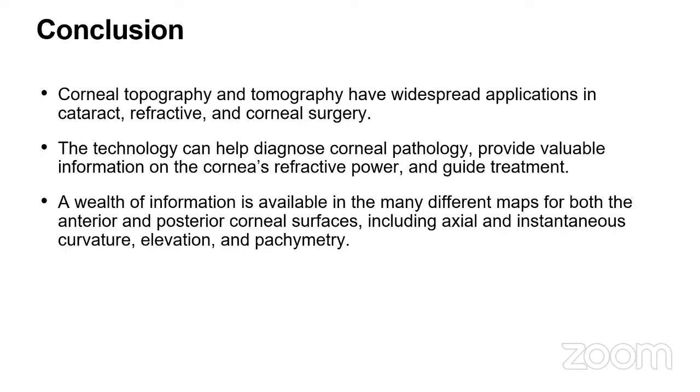Conclusion: corneal topography and tomography have widespread applications in cataract, refractive, and corneal surgery. The technology can help diagnose corneal pathology, provide valuable information on the cornea's refractive power, and guide treatment. A wealth of information is available in many different maps for both anterior as well as posterior surface, including axial, instantaneous curvature, elevation, and pachymetry maps.